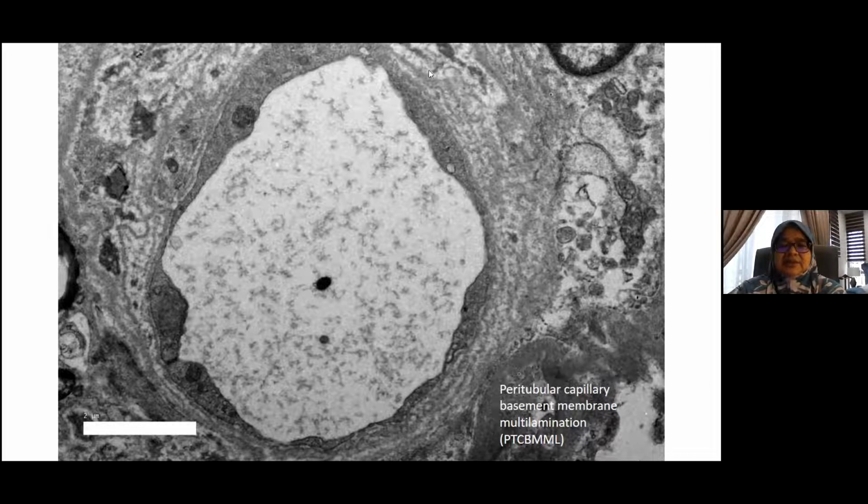And the peritubular capillary is lined by endothelial cells. And we can see this classical peritubular capillary basement membrane multilamination, PTCB MML. Okay, and there's a grading in the BANFF scoring: mild, moderate to severe. So I think this is a moderate PTCB MML.